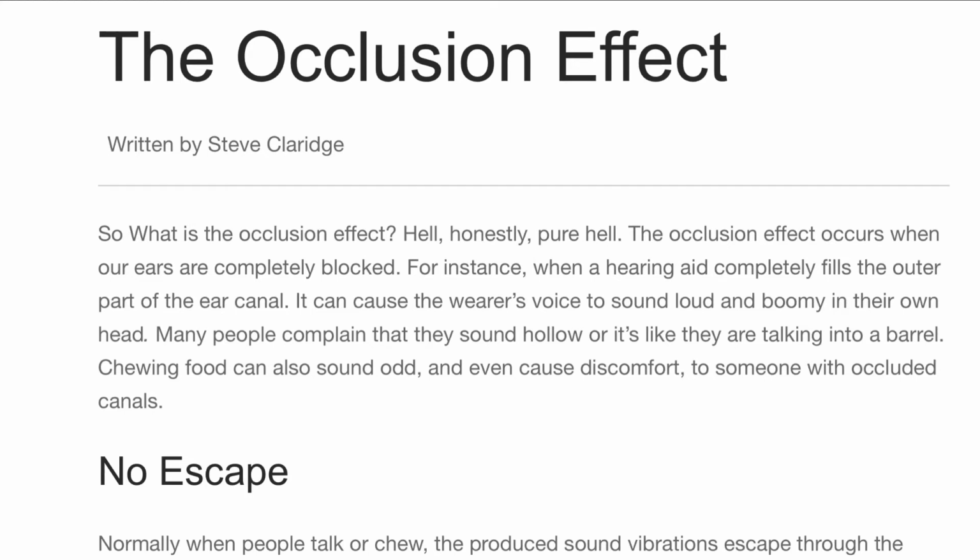This is one question I get on all hearing devices that I review. Do they have an occlusion effect? Yes, definitively they do. You literally hear an echo of your own voice, and you hear your voice inside your head at the same time that you're talking and hearing it come through the mics. So it's very frustrating. And that's something that should be dialed in at this point. Other hearable technologies don't have that issue. So that's one thing I'd be working on at this point if I was Olive.